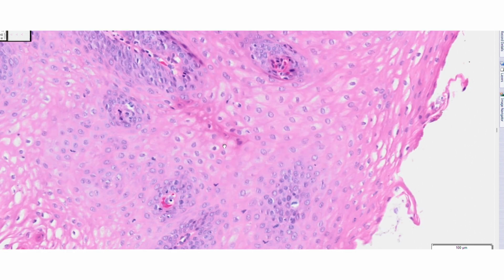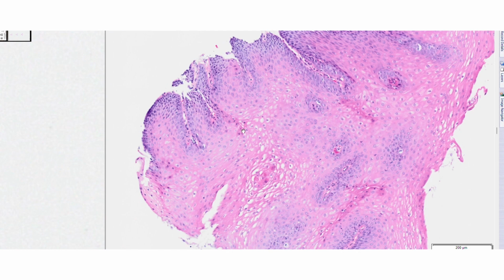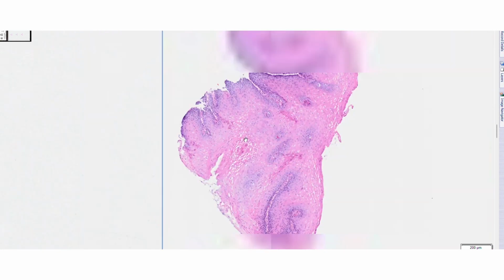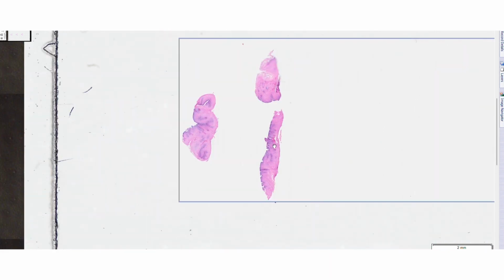That must be this particular worm's food, otherwise it would not be embedding its head into the tissue. It is eating the glycogen from the cells of the tissue, and that's why these cells appear cleared out. The glycogen has been eaten out of it, I believe.